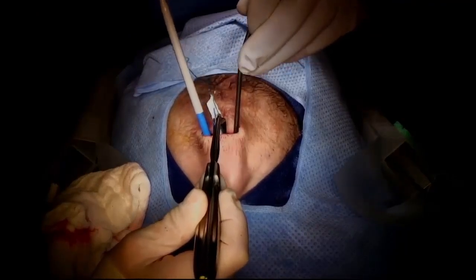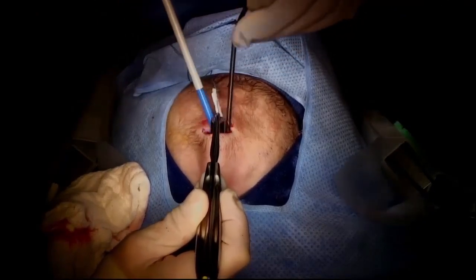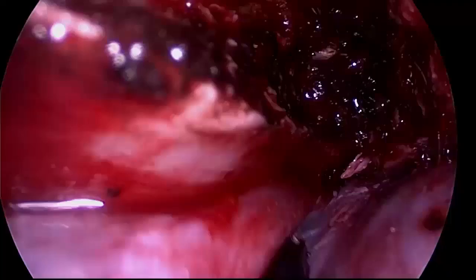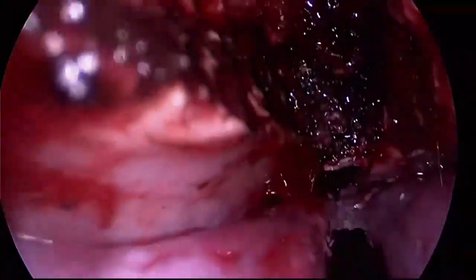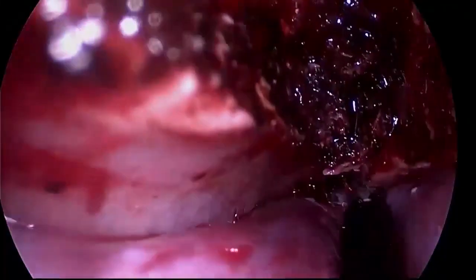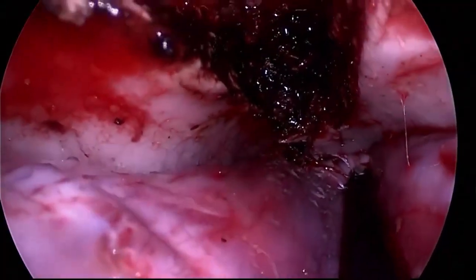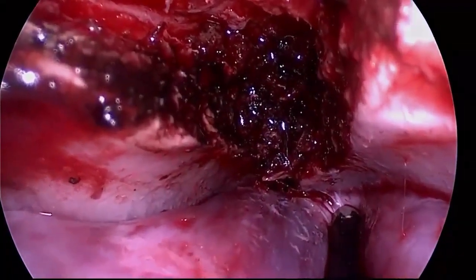On the right hand, the suction electrocautery is cauterizing the bone. The rhinoplasty lighted retractor safeguards the scalp from getting burned, and the endoscope allows us to see complete resection of the bone down to the nasofrontal suture. Inspection of the dura is made to make sure that there are no CSF leaks or unnecessary bleeding, as demonstrated here.